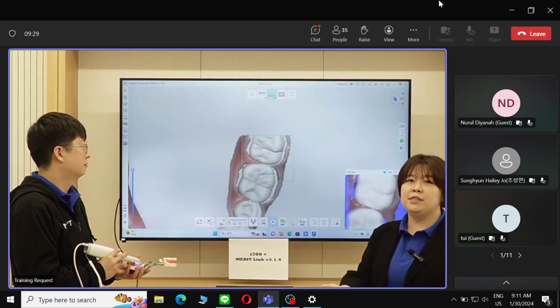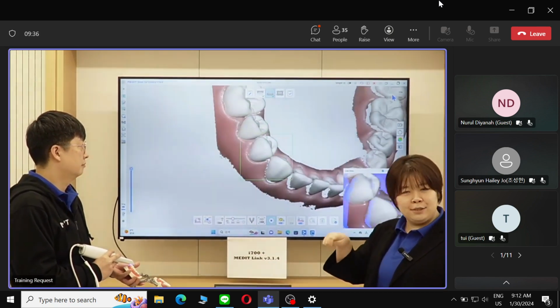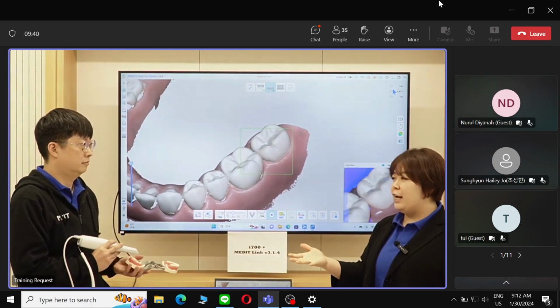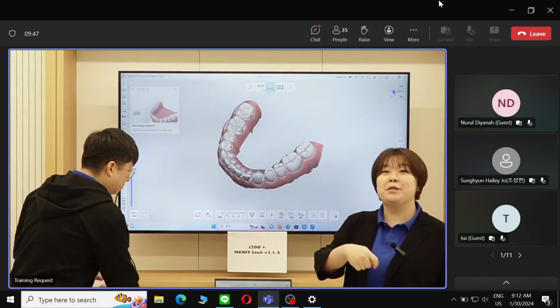If you're a person who is experienced with intraoral scanning, your body is probably accustomed to scanning in the right way because you're conscious of the scanning technology and the scan strategy. So with the previous version, you had no problems. You would say, you know, scanning is good.